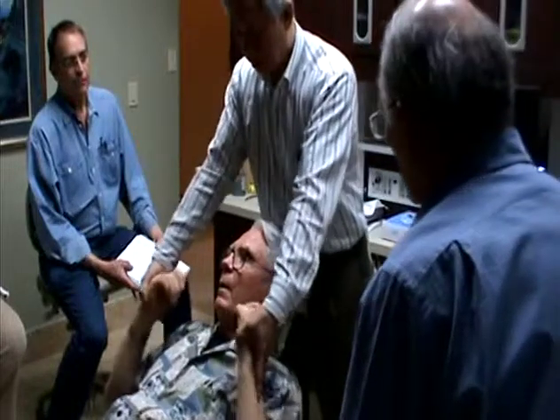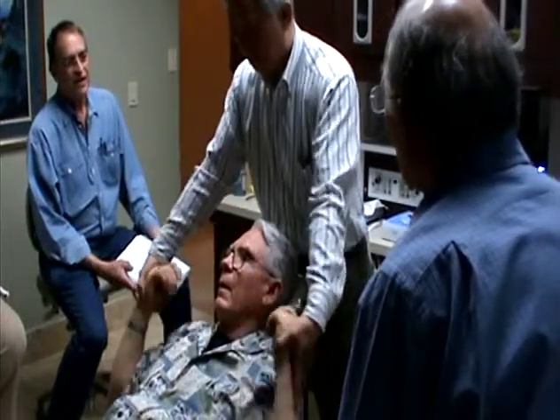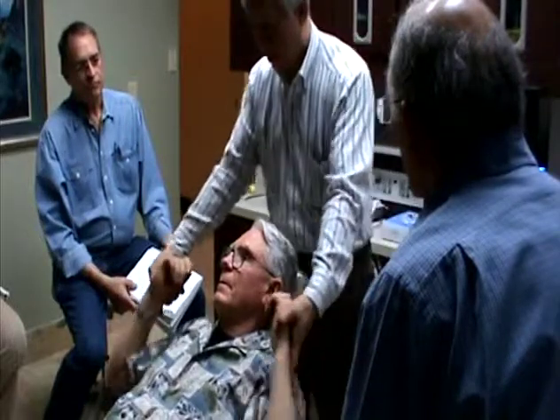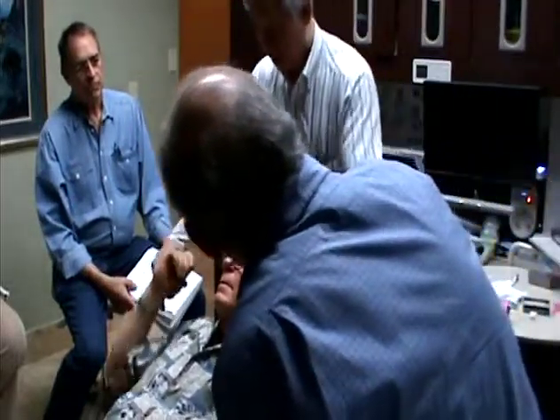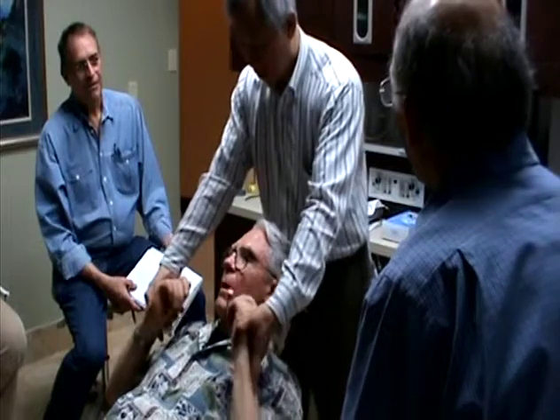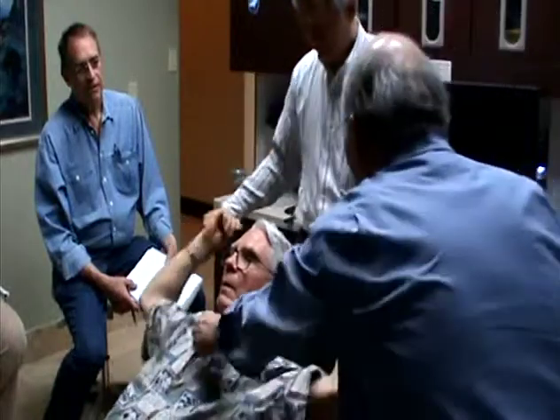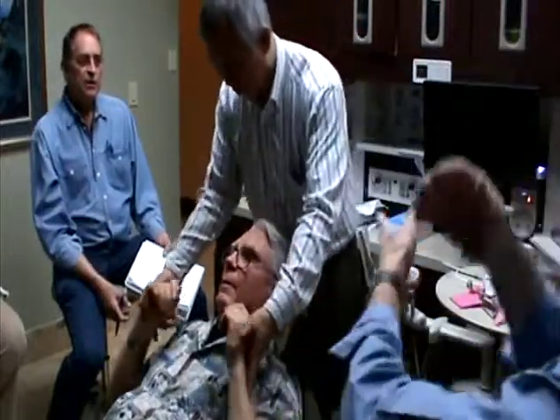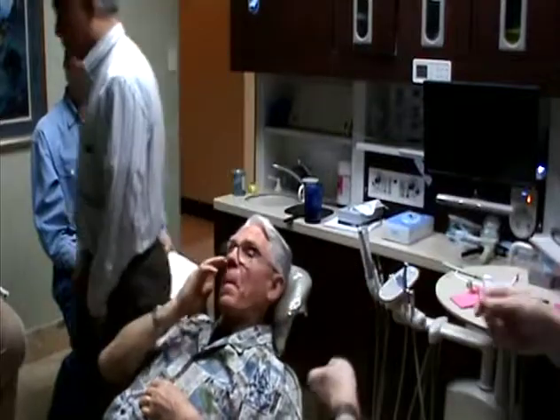Okay, may I? Go limp and ragdoll loose. You want his mouth open or closed? Mouth open, please. That's loose. Now, teeth together, please. Open first. No, right side tightened up, huh? Same thing. Is that bite paper on the same side? Didn't matter. Okay, thank you. Opposite side, it wasn't a stunning difference, but you got the right side both times. Tighten up.